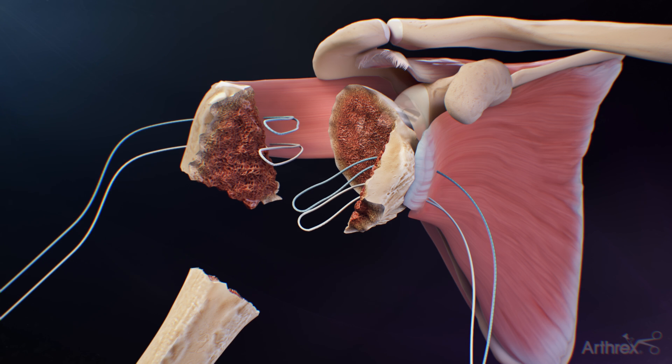the humeral head fragment is removed from the wound. Prepare the glenoid per the specific glenoid system surgical technique being used, then prepare and trial the humeral components.